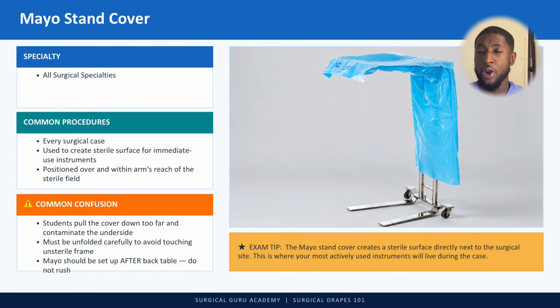Let's say you're busy on the back table, excuse me. And then the sterile field is where the doctor can grab the things that they need without having to ask you. It's used for every surgical case. It's used to create a sterile surface for immediate use instruments. It's positioned over and within arm's reach of the sterile field.